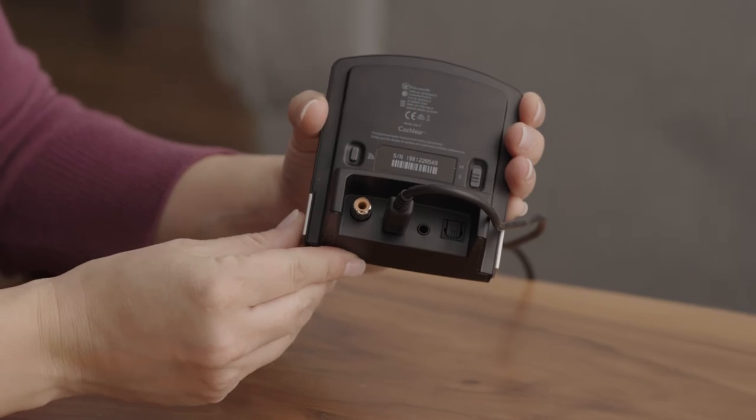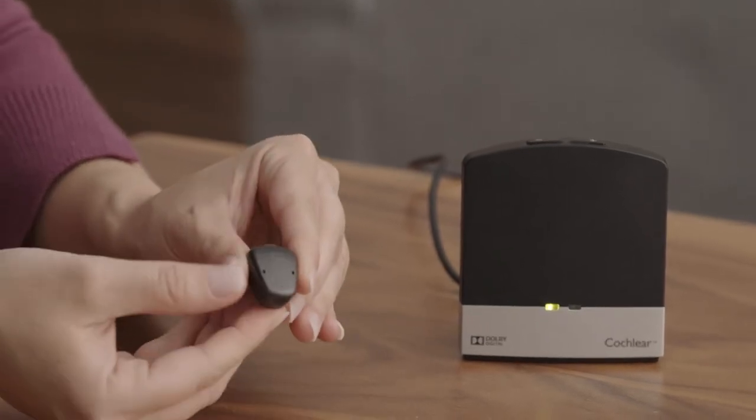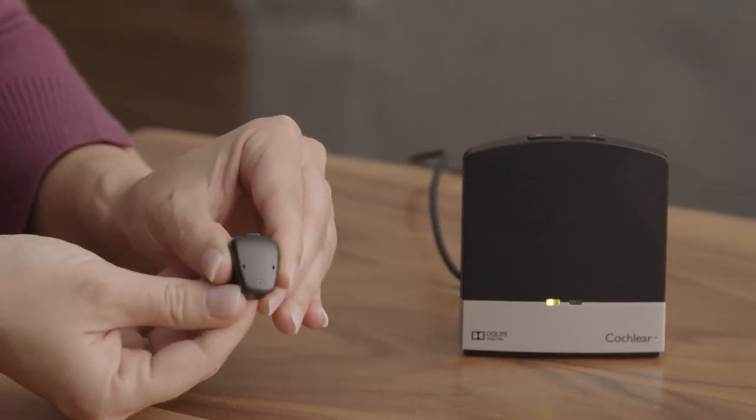You'll notice there's a Wi-Fi symbol next to the button. The light on the front of the TV streamer will blink orange for 20 seconds to indicate it's in pairing mode. While the TV streamer is blinking orange in pairing mode, turn your processor back on by fully closing the battery door.